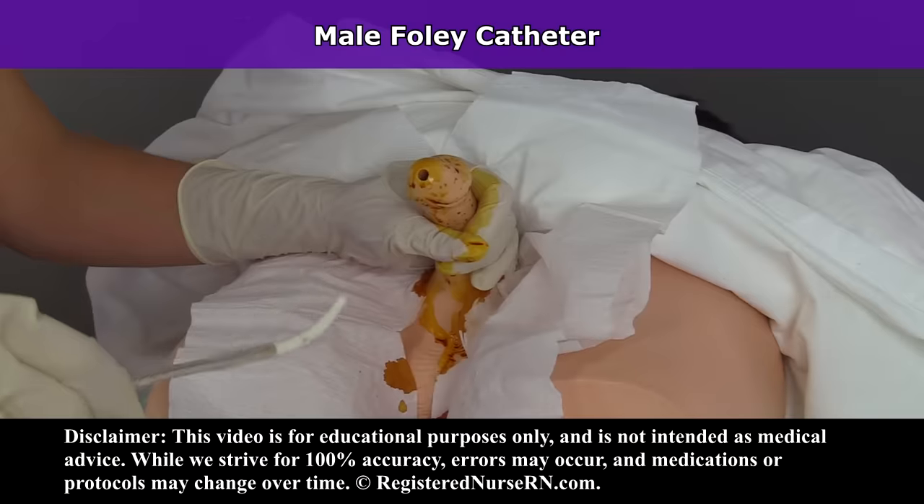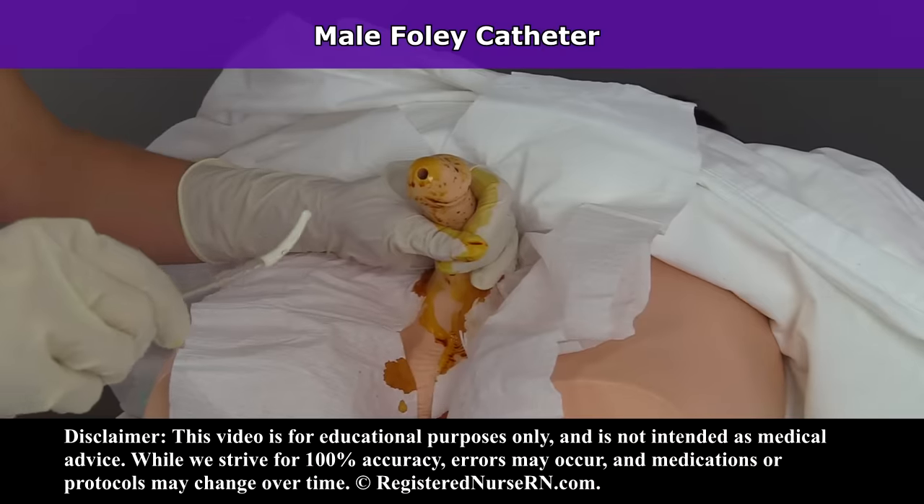Hey everyone, it's Nurse Sarah and in this video I'm going to show you how to insert an indwelling Foley catheter on a male patient. So let's get started.